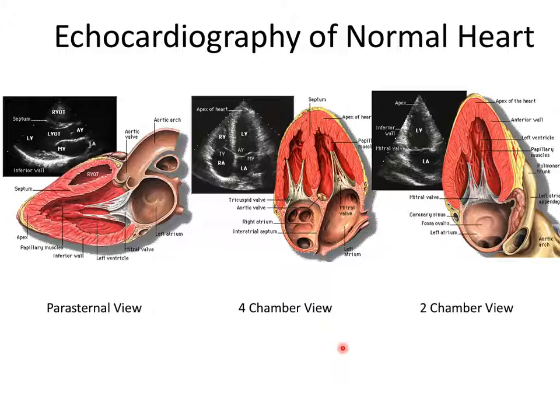For MR and CT, those imaging physicists and imagers who are on top of cardiac always provide data in these orientations. It's easy to provide data in an arbitrary orientation with MR and CT. But cardiologists know these orientations very well. And so when they look at a movie in one of these orientations, they instantly understand what they're looking at, right? Which walls they're looking at in the heart. That's because they've been looking at these orientations with echo for 40 years or something, or maybe 30, right?